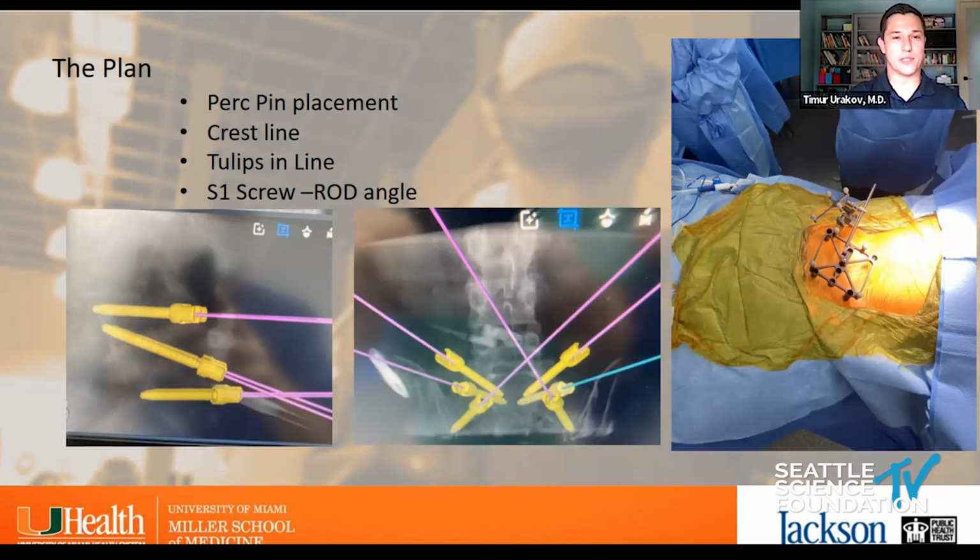But this is kind of the preoperative planning of an MIS technique, percutaneous versus a two-stage procedure, prolonged hospitalization, painful recovery. This is all done in prone, percutaneously. And I'm going to take you step by step through what I actually do. Some of the considerations, of course.